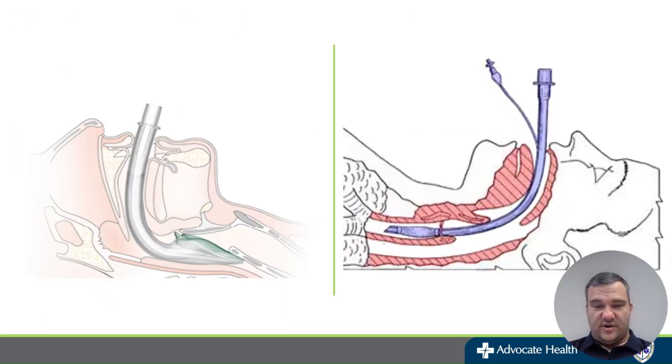And then this is what I've been talking about on these slides recently. This is showing an iGel device and where it sits within the glottis and the opening down there, versus the ET tube. With the iGel device, you can see that it goes in. There's no balloons. There's nothing else. The idea is that it occludes the esophagus at the tip over here, and then the air exchange portion of the tube lines up nicely with the trachea.